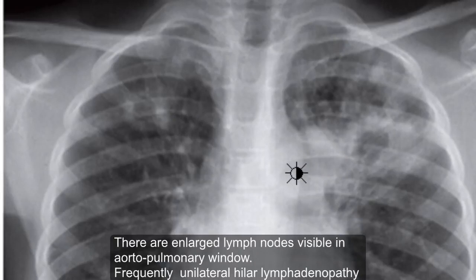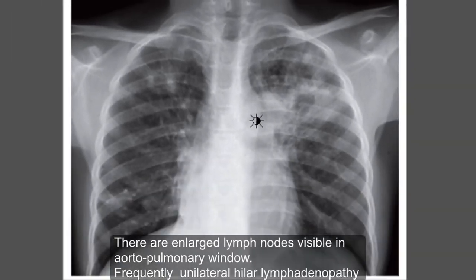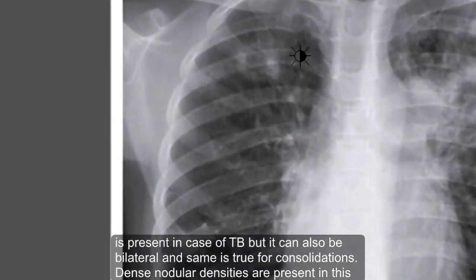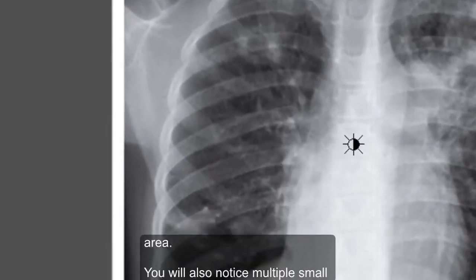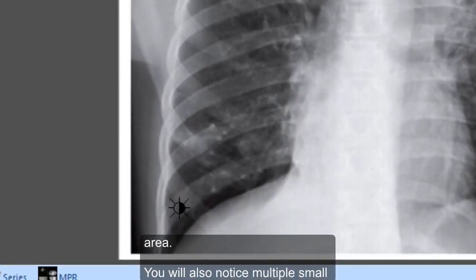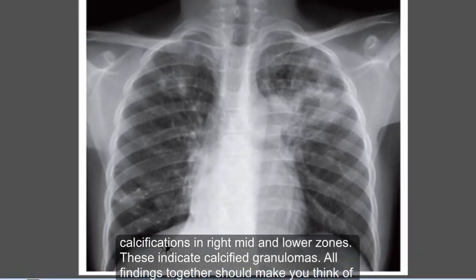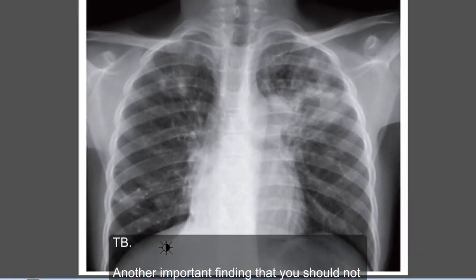There are enlarged lymph nodes visible in the aortopulmonary window. Frequently, unilateral hilar lymphadenopathy is present in cases of TB, but it can also be bilateral — and the same is true for consolidations. Dense nodular densities are present in this area. You'll also notice multiple small calcifications in the right mid and lower zones, indicating calcified granulomas.